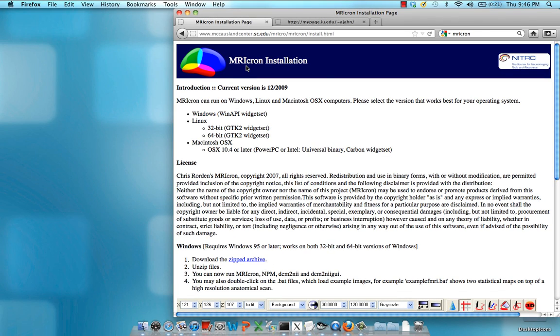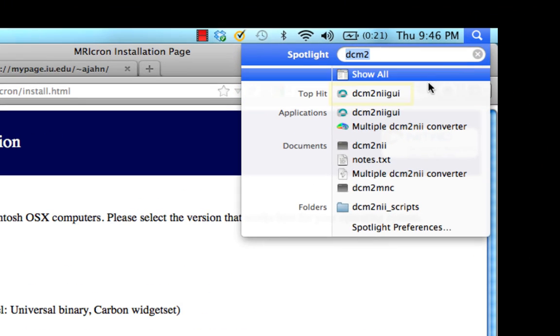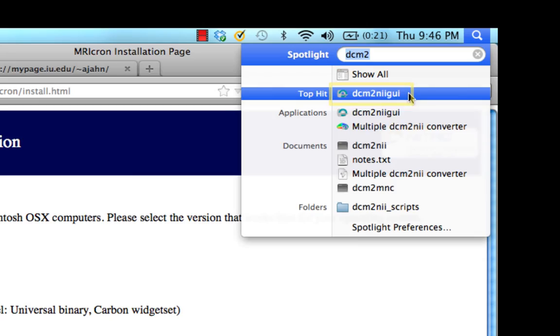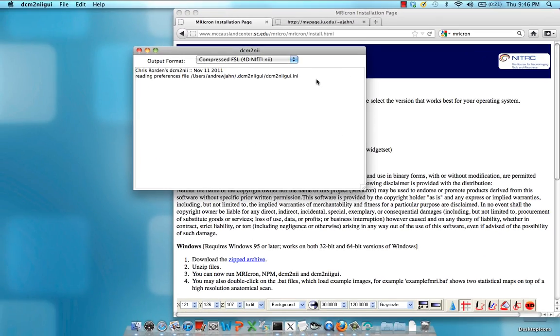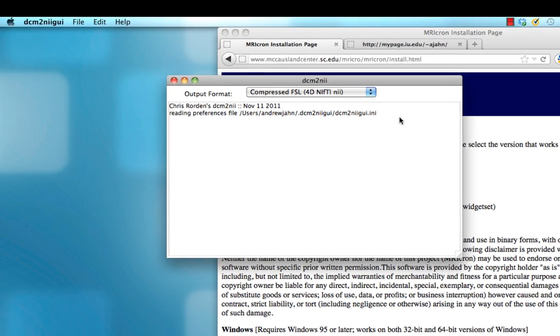Once you're done downloading and installing MRICron, go ahead and look for the DCM to NII GUI program. DICOM to NIFTI is a very simple interface and it's very easy to use.